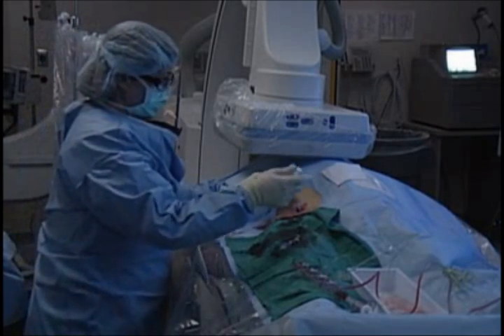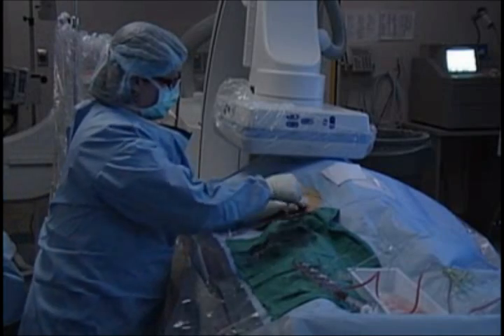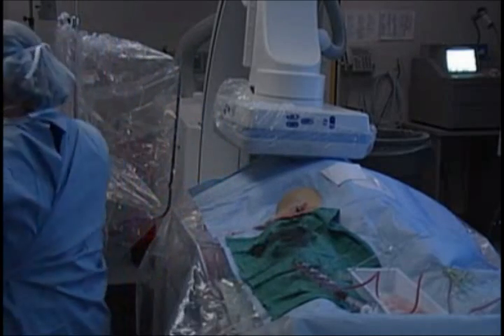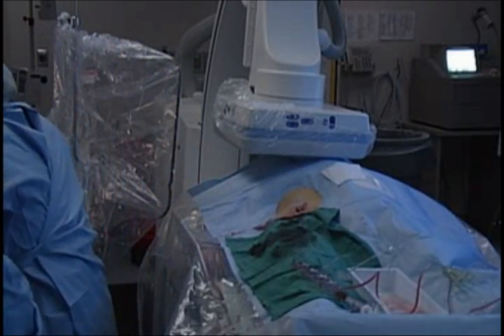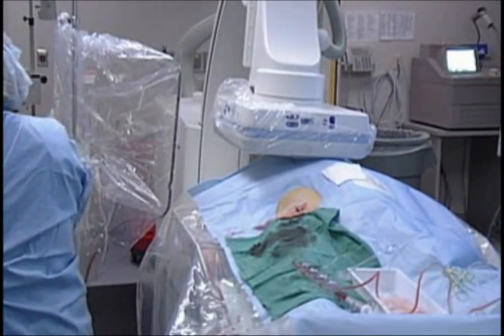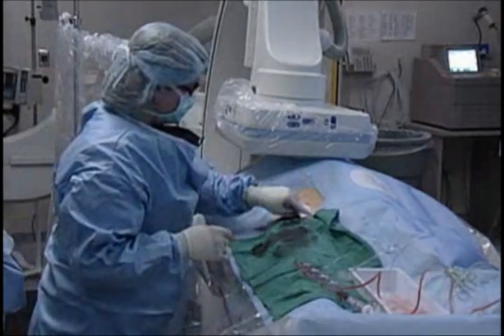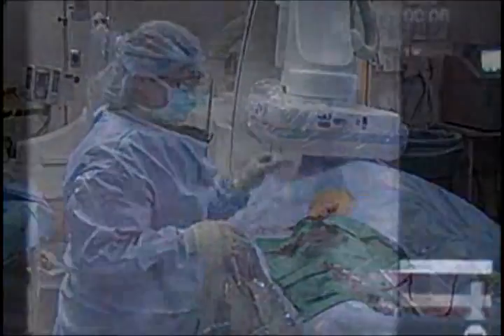In a little while we'll flip forward to the angiographic images showing that material going in. After the material is in and the small amount of gel foam is administered, that catheter is removed and the sheath is removed. We use a variety of closure devices, which sometimes allow the patient to be up and walking within about 30 minutes.